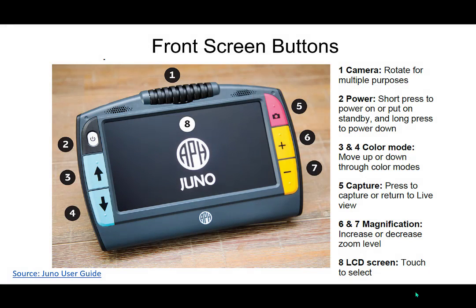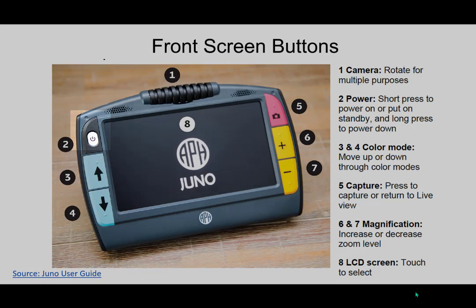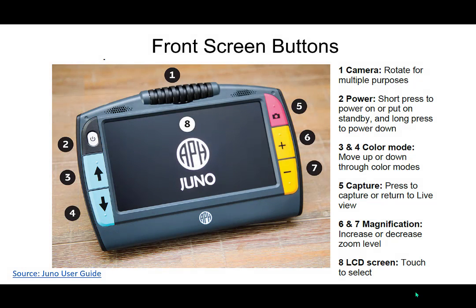If you move your hand to the upper left corner button, it's a sort of grayish background with a white button on there, and it has a power symbol on it. This is the power button. This will turn the unit off and on. It will also put it in standby and take it out of standby. There are two buttons below the power button. They are the color mode up and down buttons. They are blue in color with black arrows pointing up for the top button and down for the bottom button. These cycle through the color modes.